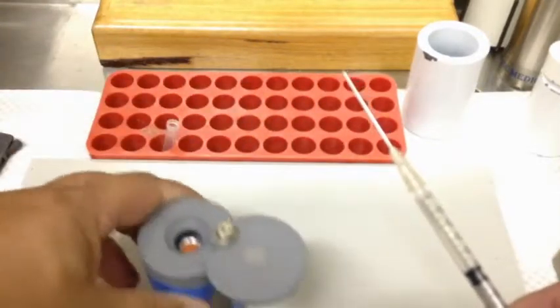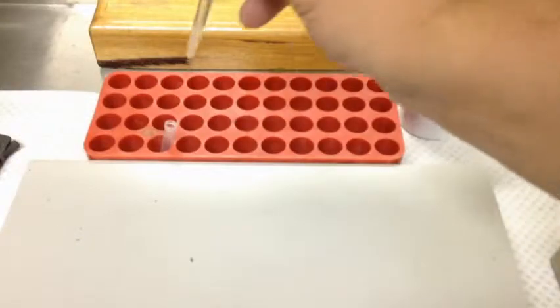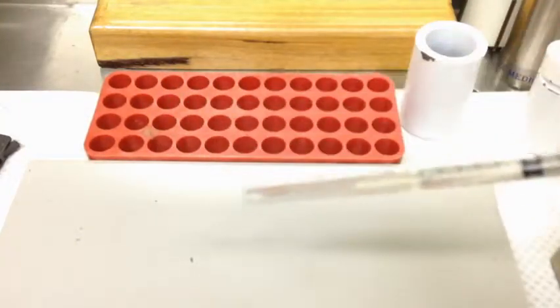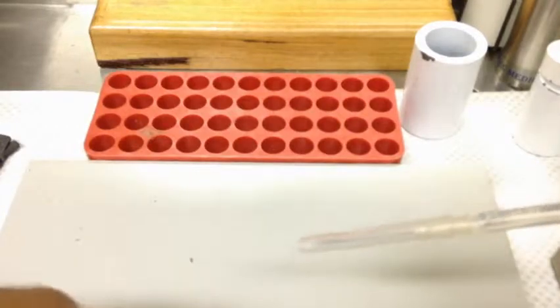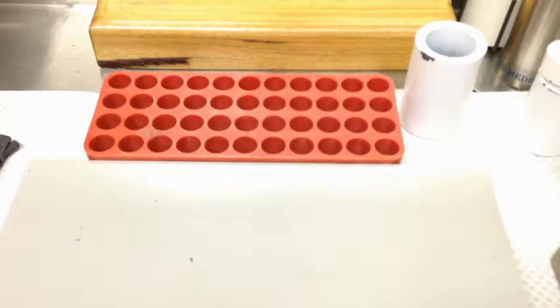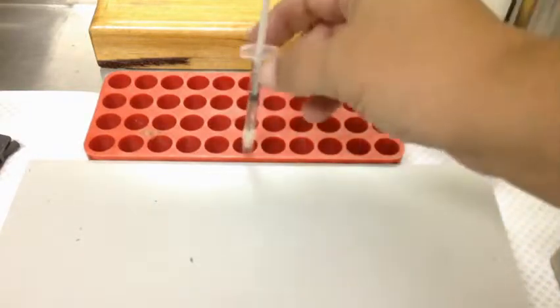We drop our MDP vial and store it at the back. Before drawing that dose, we checked the label, made sure it hasn't expired, and then this goes into the dose calibrator for assay. It came out to about 788 MBq because we did our calculations correctly.